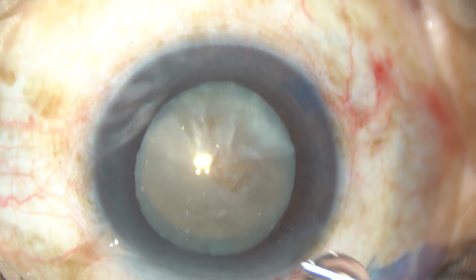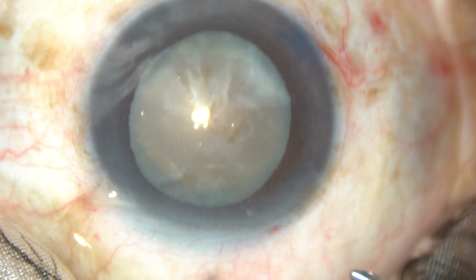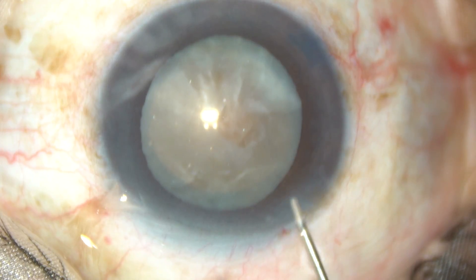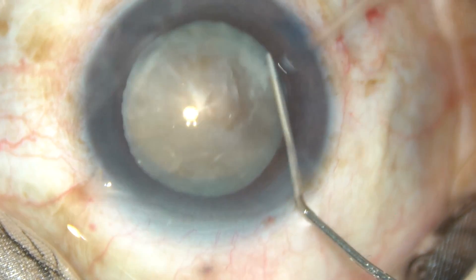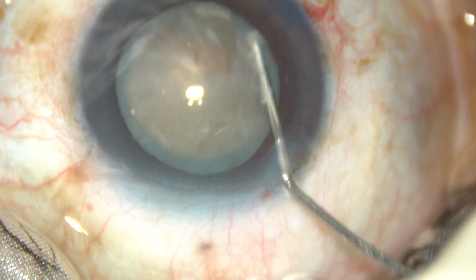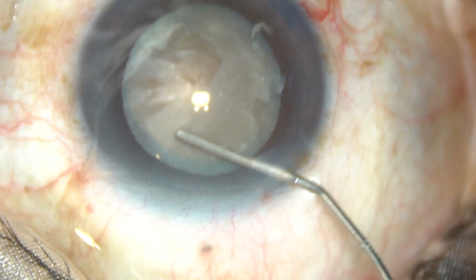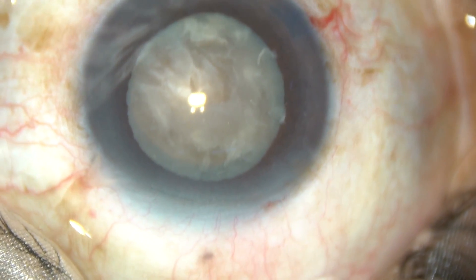And now hydrodissection. Hydrodissection is done at multiple points. The nucleus is mobilized gently, and then we can see that the nucleus is free — it rotated very nicely.